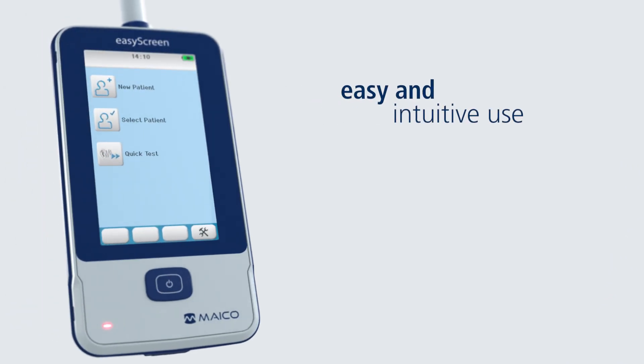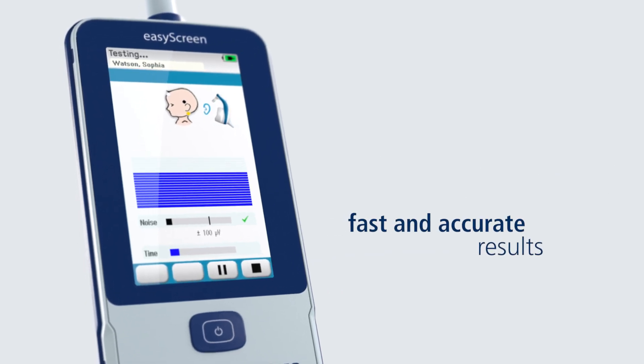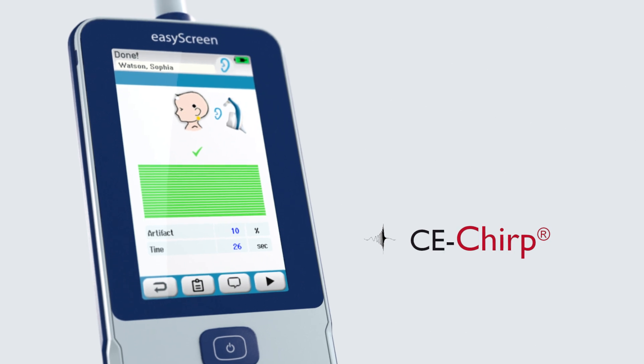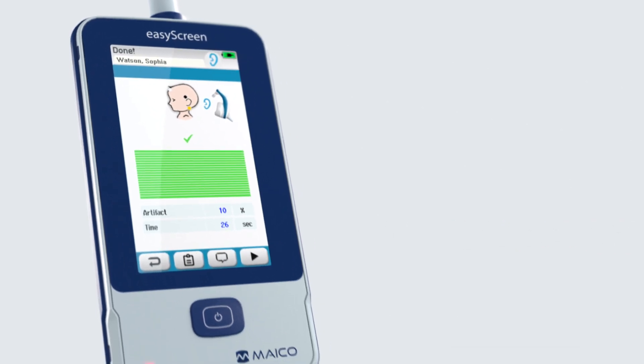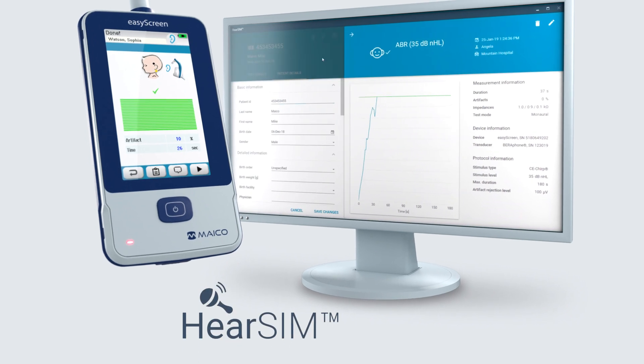Designed for easy and intuitive use, the easyScreen guides you through the test on the large touch screen. It generates fast and accurate results with our patented CE-Chirp and response detection method, and lets you manage patient data easily with our dedicated HearSIM software.